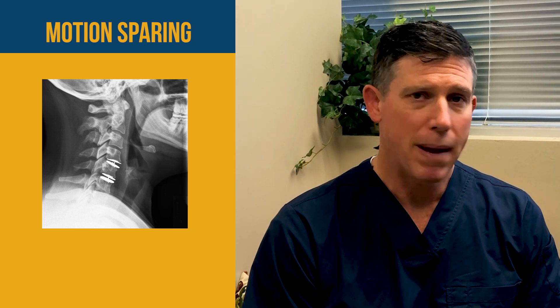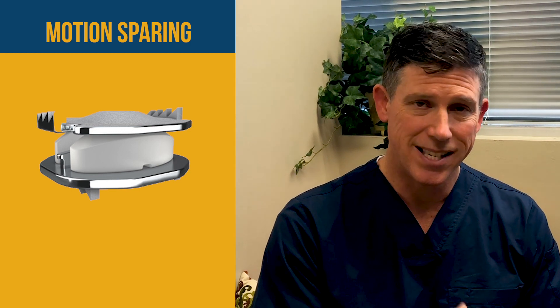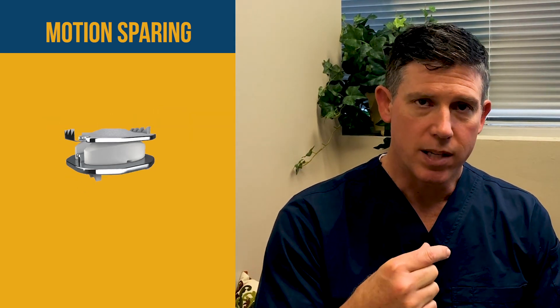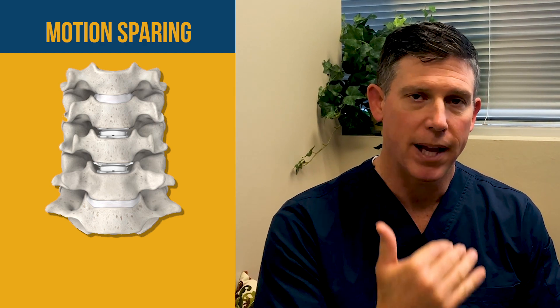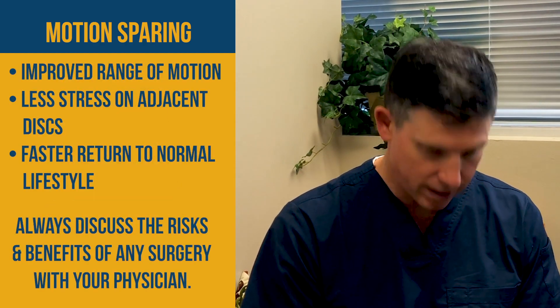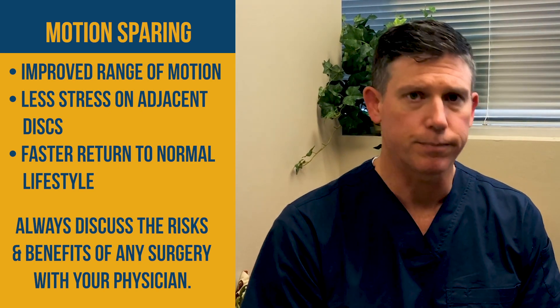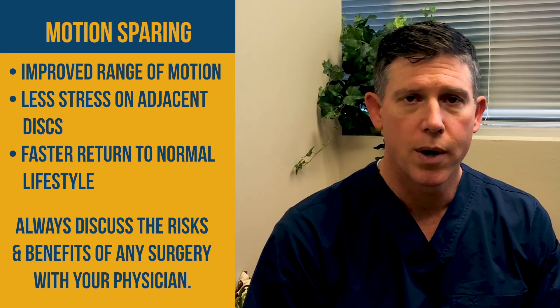Then we had this motion-sparing option, where she had basically the same procedure all the way up until the bone plug is put in. Instead of the bone plug, there's a little unit called the MOBI-C. This unit is put into the disc space, and then the top plate and the bottom plate grow into the bone and become very solid. The vertebrae can still move — you still have your motion — and it doesn't put as much stress above and below the disc.